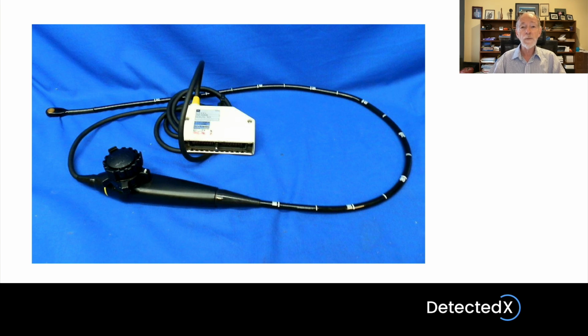Then we have invasive probes. These probes are typically used in areas where tissues overlying the area of interest cause too much degradation of the ultrasound image, or perhaps block imaging entirely of the area of interest. And of course, the things that typically do this will be air and bone.